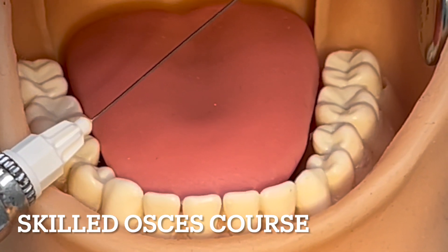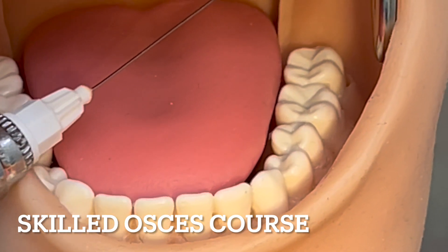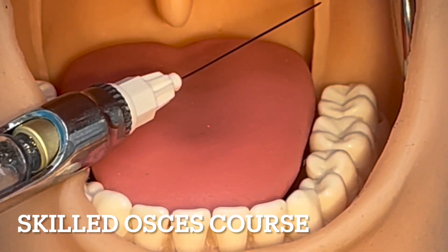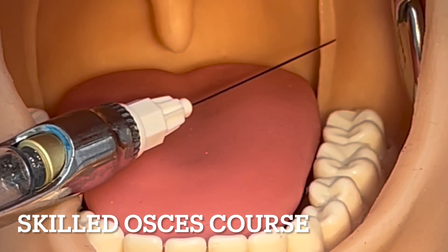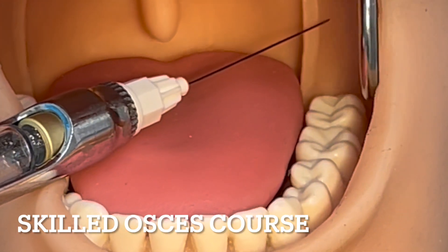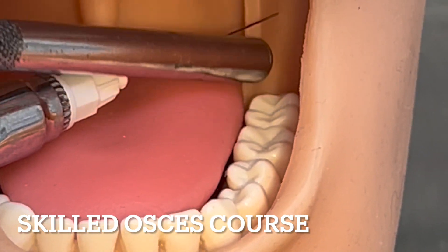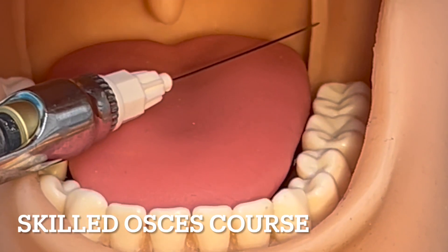You position the carpule as if it's coming from between the opposing premolars and roughly one centimeter above the occlusal plane. This space right here is roughly a centimeter or slightly higher. Keep an eye on it.